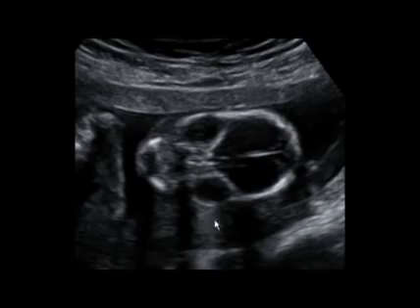What do I mean by orbits? I want to see two bony orbits, here and here. They should be symmetrical in the head. It's not enough to just see the top orbit. Both of them need to be identified.